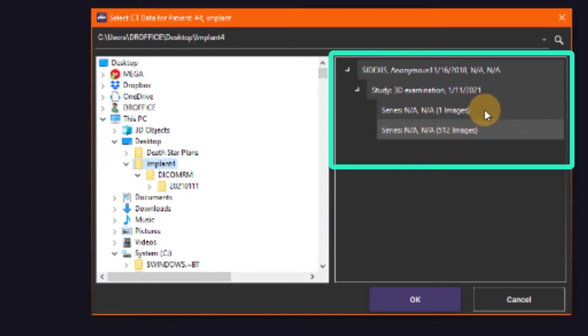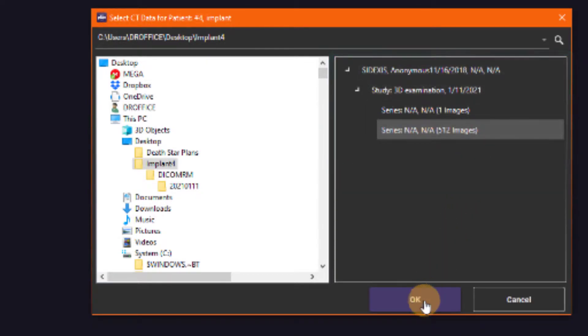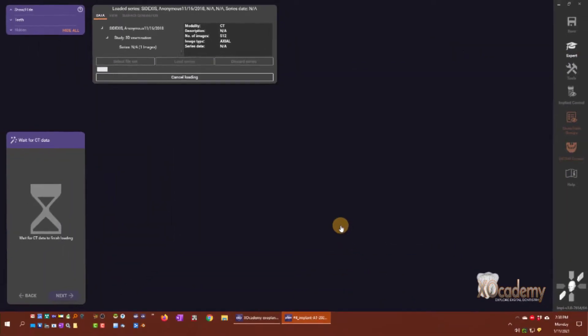We either have a single image series or a series with 512 slices. That obviously is the CT data that we're looking for. So we load our CT data.